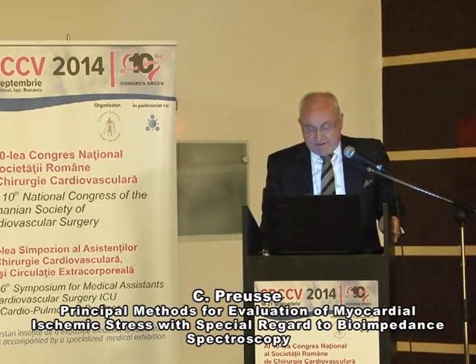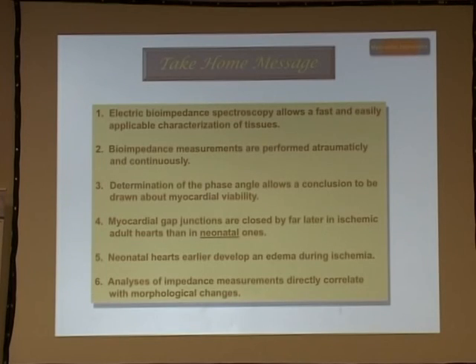And now I finally will give you the take-home message. The electrical bioimpedance spectroscopy allows a fast and easily applicable characterization of tissues. Bioimpedance measurements are performed atraumatically and continuously.